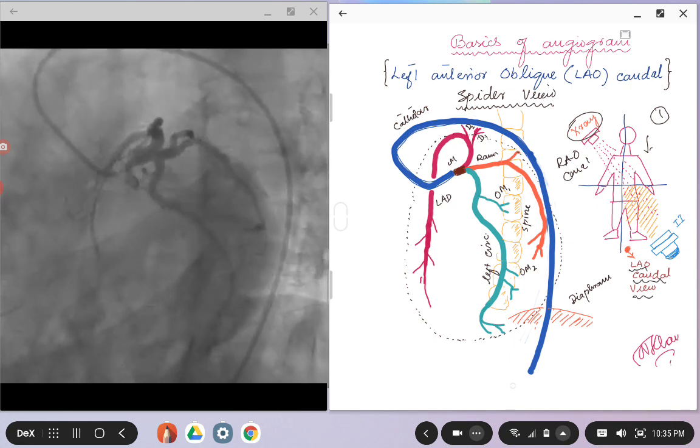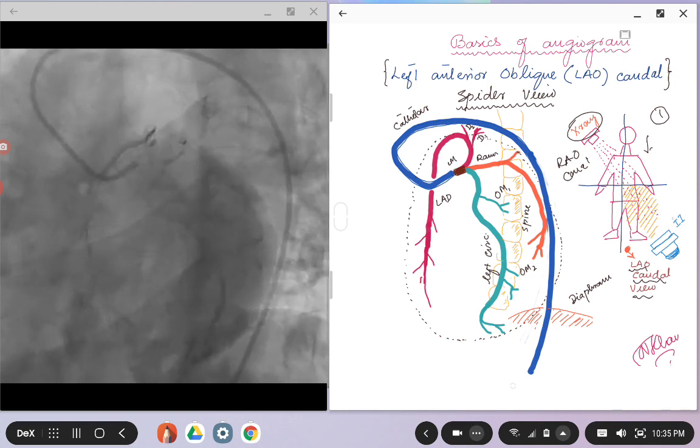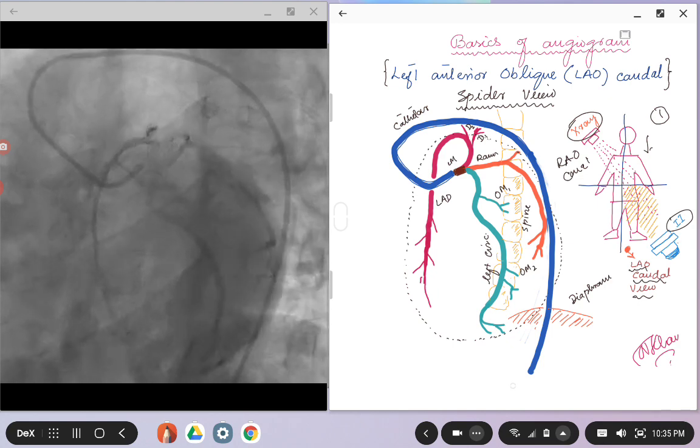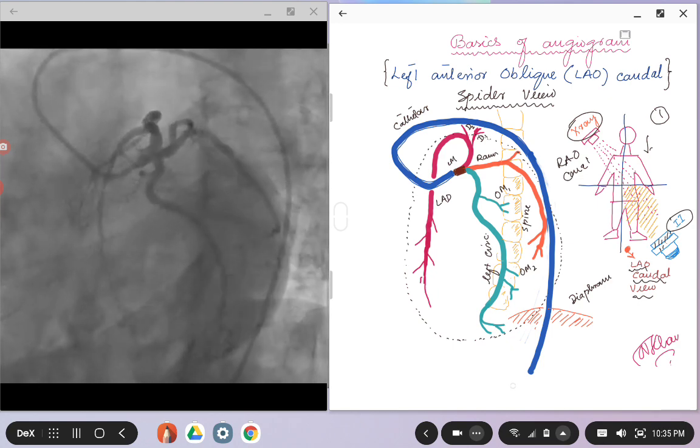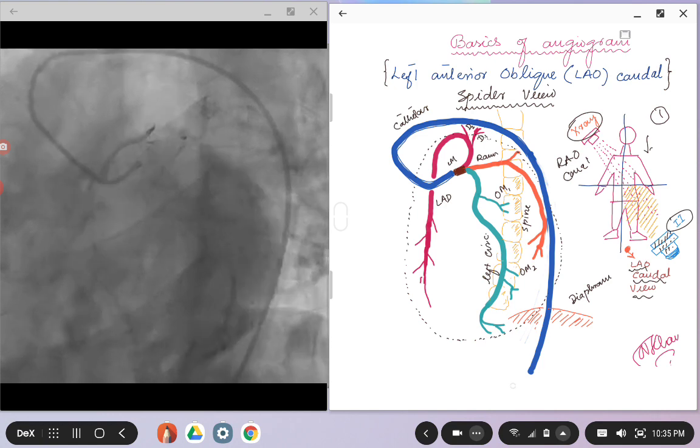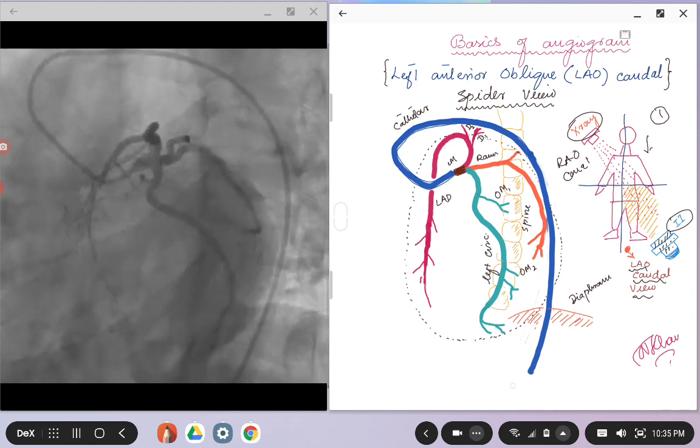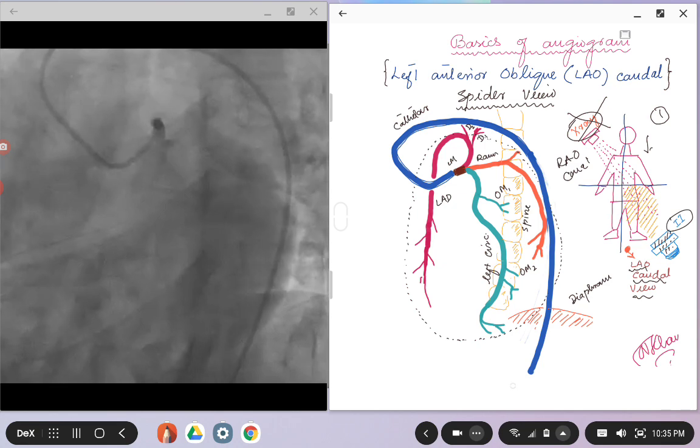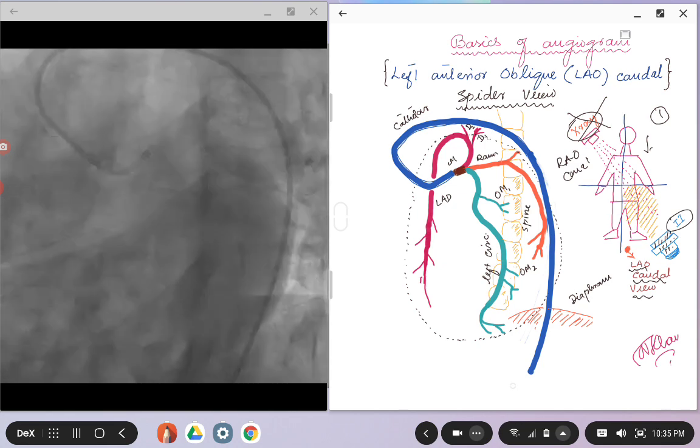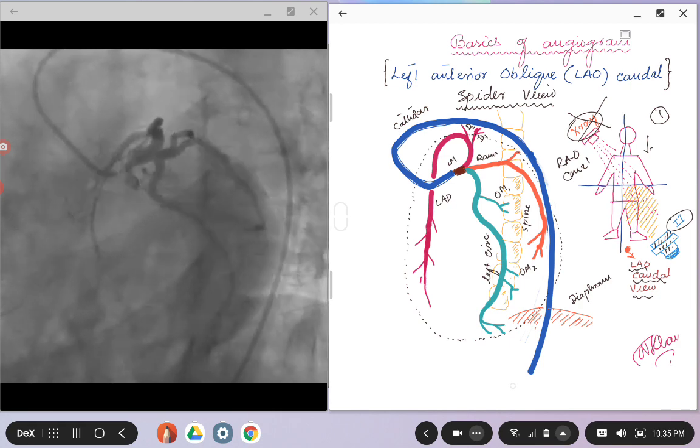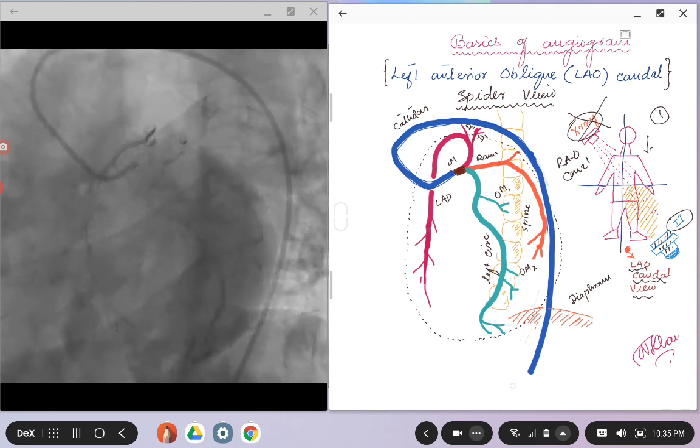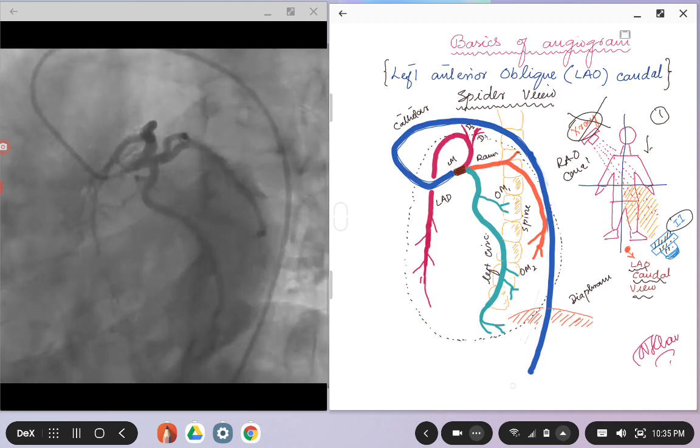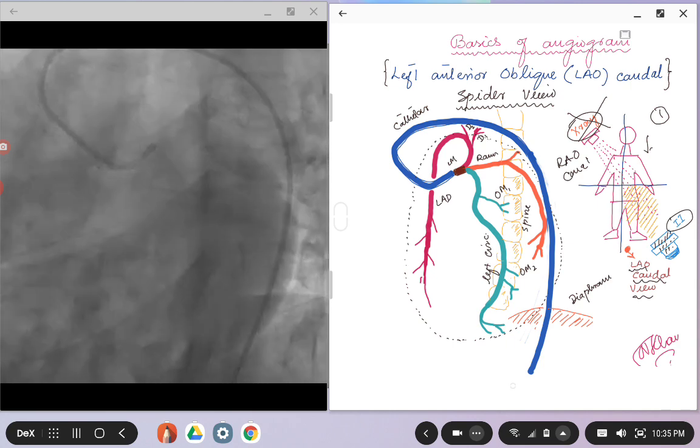Again, just to refresh the memory, the image is labeled by the image intensifier, so wherever the image intensifier is, that counts your image, not the x-ray source. But it is important to know where the x-ray source is, and that's when things will start to come together and you will get an idea of what structures you are seeing.